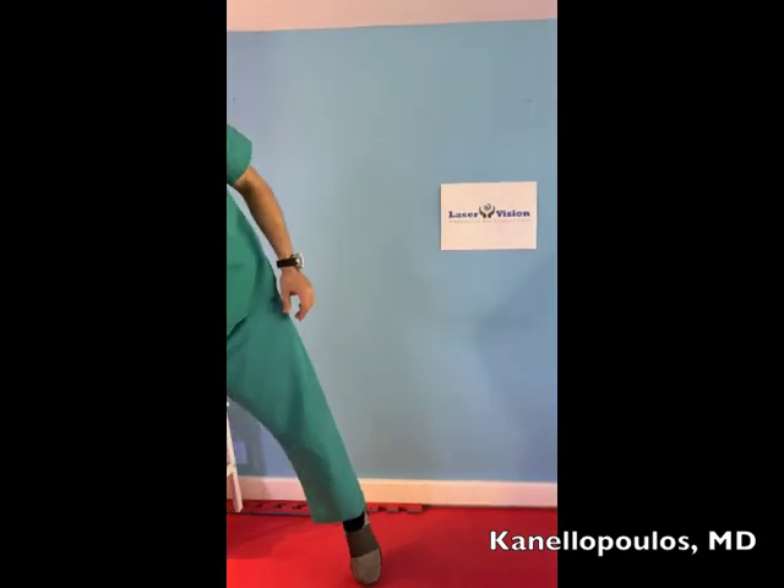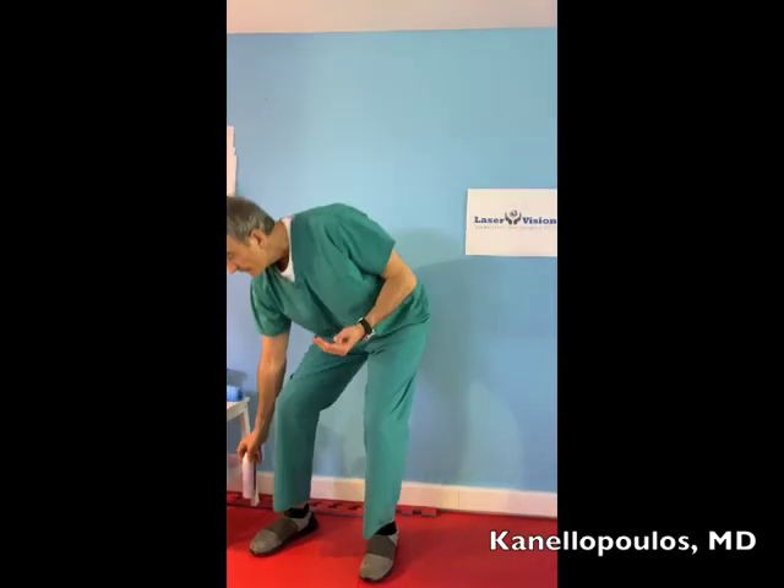To share with you the proper way of gearing up and ungearing with personal protective equipment, especially in these days that special attention should be given. So the first thing I need to do is to clean my hands — this is just alcohol foam. Otherwise, lathering your hands with soap for 20 seconds is appropriate, or antiseptic gel. So I have clean hands now.